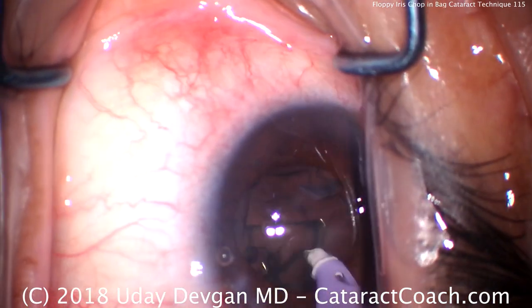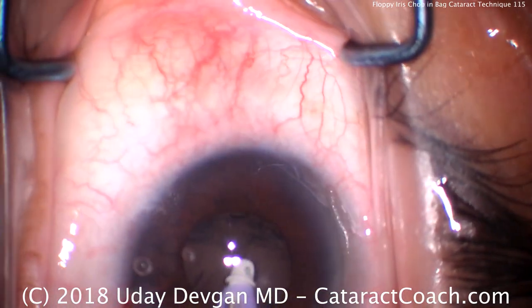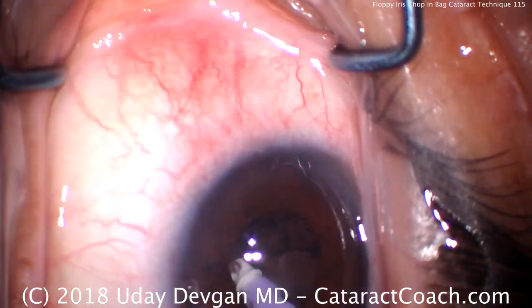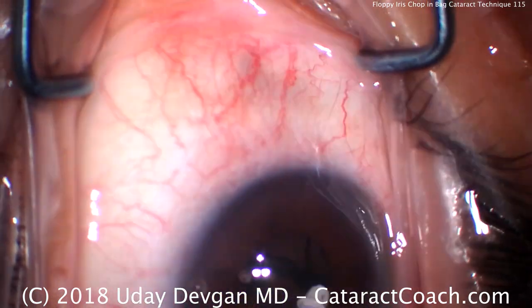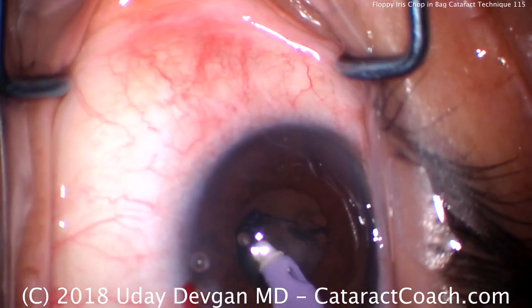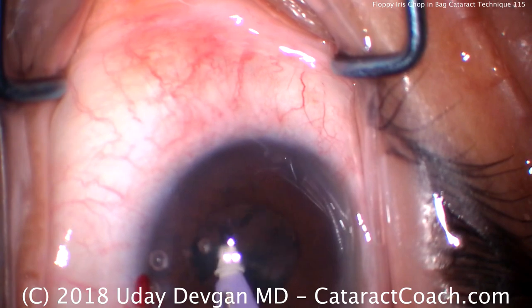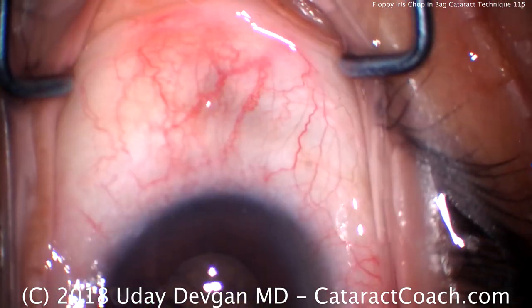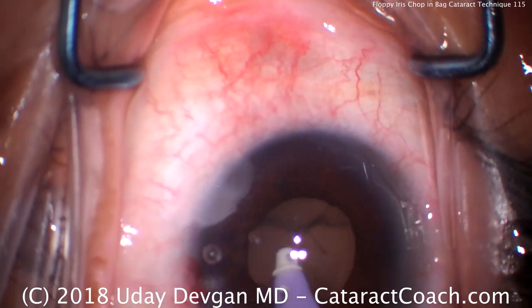There we go — that's most of the epinucleus, and now we're just going to clean up the cortex. We're using a coaxial IA probe here. A bimanual approach is also very effective — we'll show you a video of that. The bimanual approach for the smaller pupil allows you to get the subincisional area pretty well. Here, I'm pivoting the eye out of primary position intentionally to access the subincisional cortex — that's why the eye drops down out of view for parts of this procedure. Still a little bit of cortex left. I'm bringing the eye out of primary intentionally to access the subincisional area — that's about one of the few times I like to get the eye out of primary.